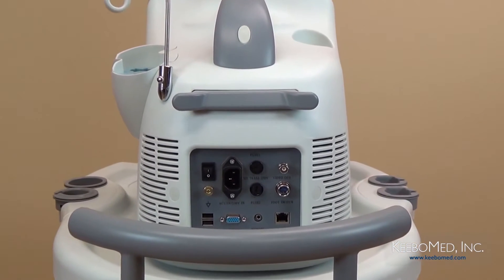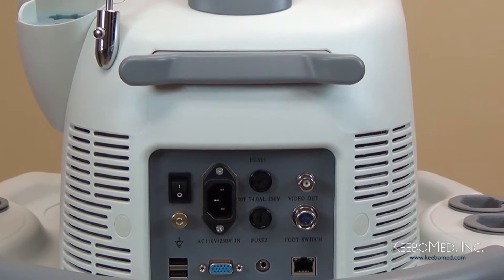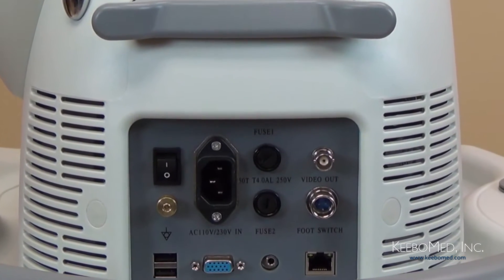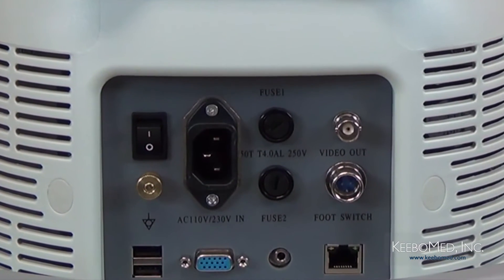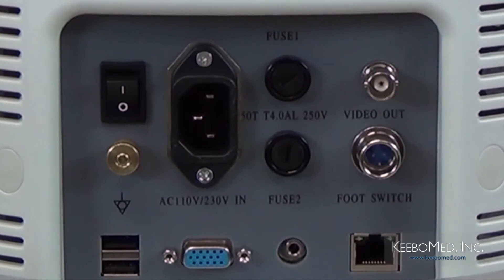In the first column of the ports is a power switch. Next is a ground connector and at the bottom are two USB ports. The second column has the power port socket and a VGA port. The third column has two fuses and a remote connector. The last column has a video out port, a foot switch port, and a LAN port.